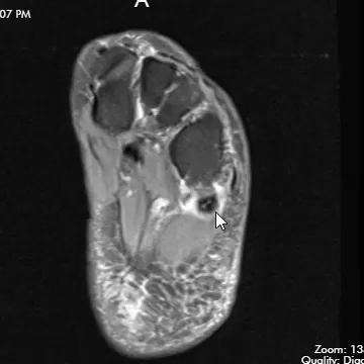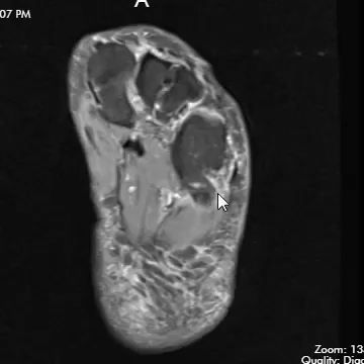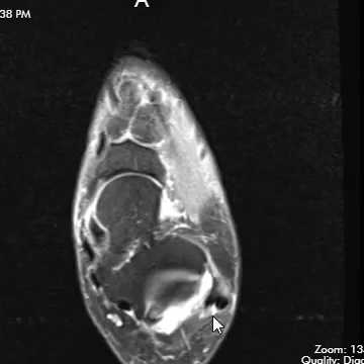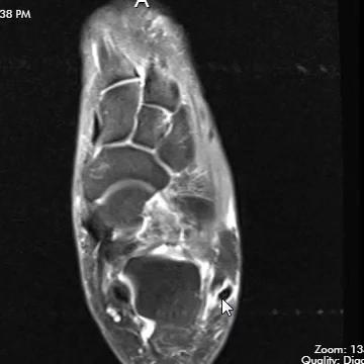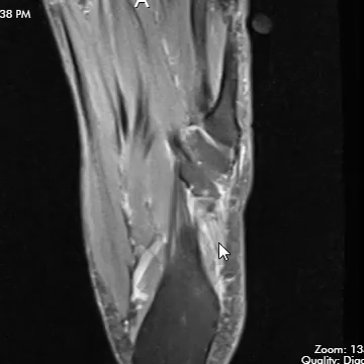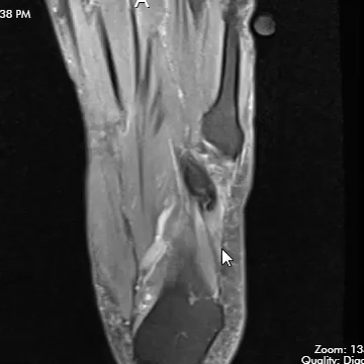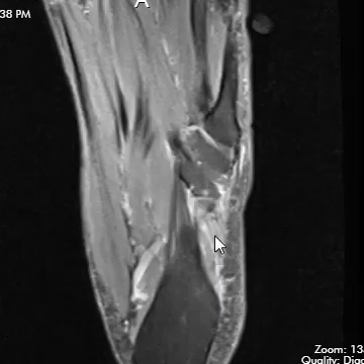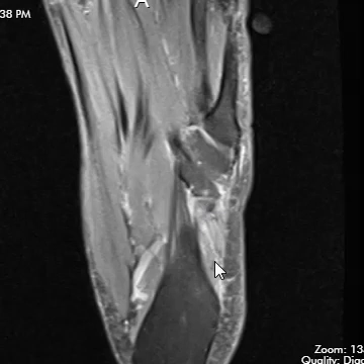Before, without having the foot in plantar flexion, it just looked like fog. Here's the peroneus longus tendon down to the tubercle — in this region, before we saw the nice split tear, but with the foot in dorsiflexion you just can't see it at all. So it's very helpful to have patients come back. Now we can tell them they do have a tear, and that is where their symptoms are from. But with the foot in dorsiflexion using standard views, it's impossible to tell what is going on on the lateral side. So we now do all our patients with the foot in plantar flexion.